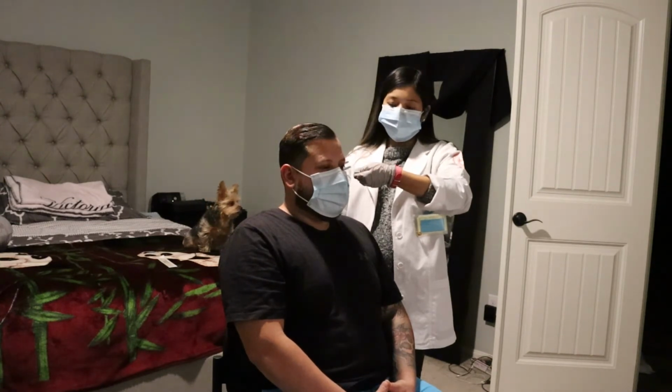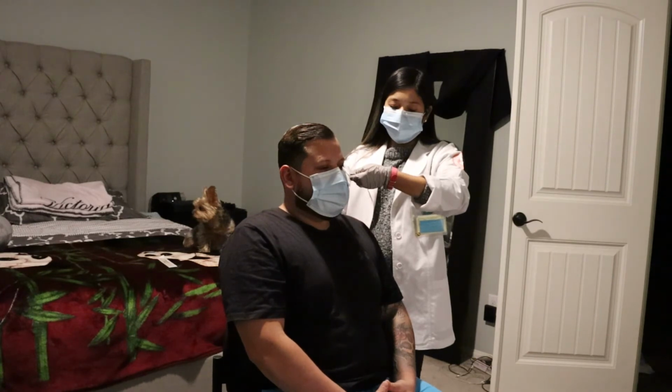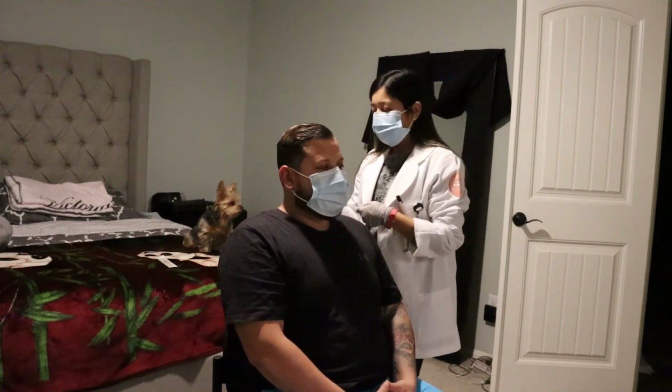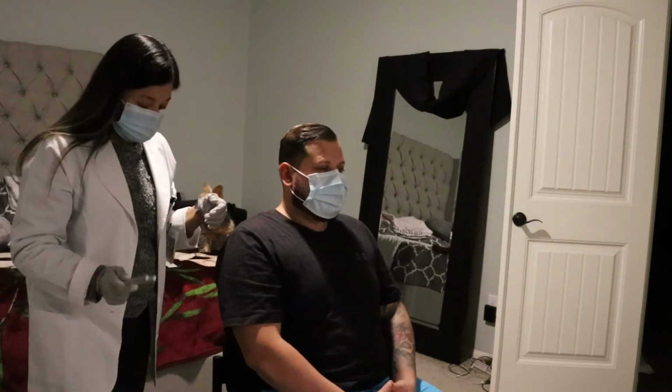I can no longer hear the vibration. Okay. I can no longer hear the vibration. Okay. Now we're going to do the same in this ear. Okay? Okay.